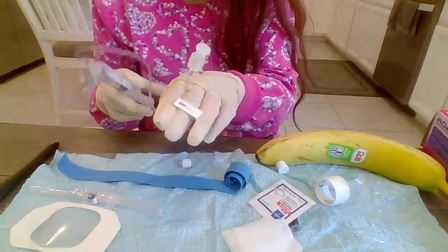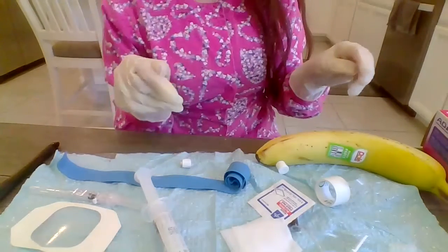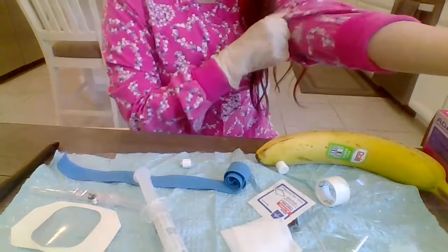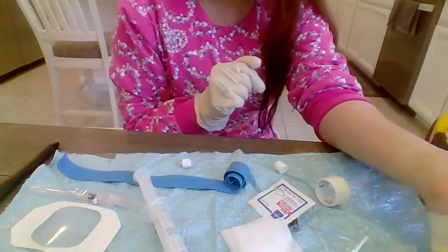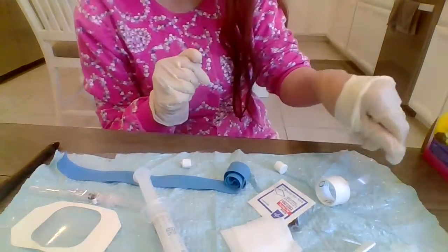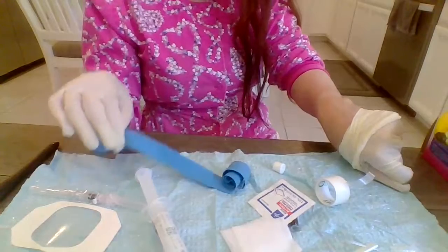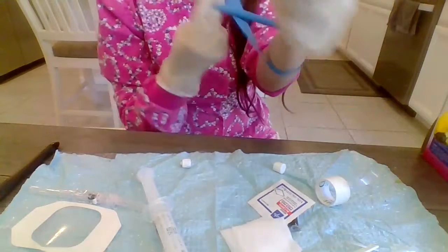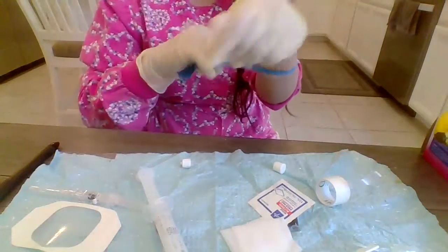Okay, so there's no bubble in there now, so I'm going to leave it attached. The next step will be selecting the IV insertion site. So let me see. I'm looking for a good, straight vein. For this demonstration, I am just going to use my arm, and then I'm going to go ahead and apply the tourniquet about 4 to 6 inches above the insertion site.